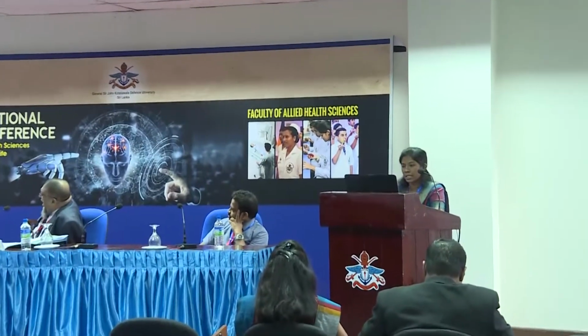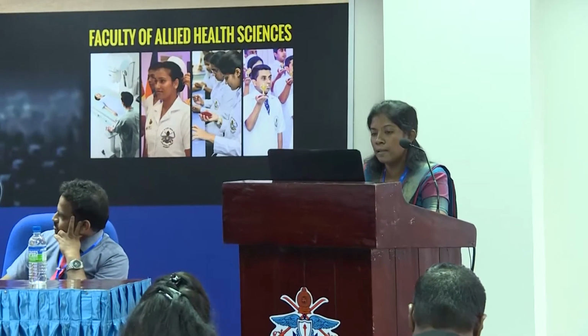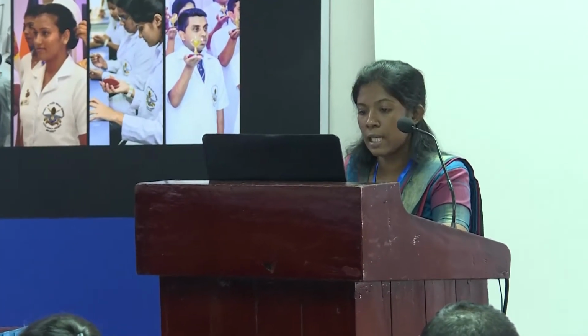in the samples with low, medium and high concentration creatinine, treated with 125 mg per deciliter and 150 mg per deciliter urea. But in the enzymatic method, only below 10% error is seen in all types of samples. Correlation and regression analysis: a negative correlation was observed between the urea and creatinine concentration, and the regression analysis shows linear regression between the urea and the creatinine concentration, with R-squared values obtained above 0.8.